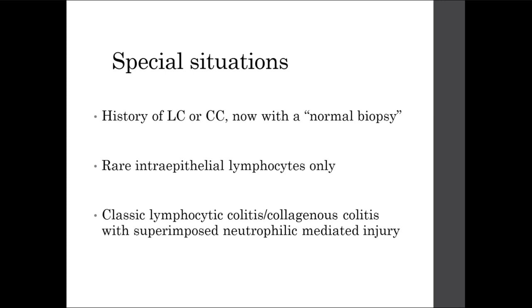However, I wouldn't argue having a few rare intraepithelial neutrophils. But if you see this as a more distinct feature, I tend to highlight this as this is not typical of this disease and may raise the possibility of a superimposed phenomenon such as medications or infections, in particular NSAIDs, I would say.